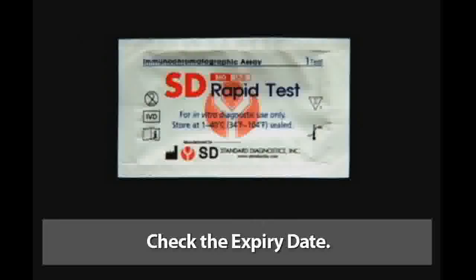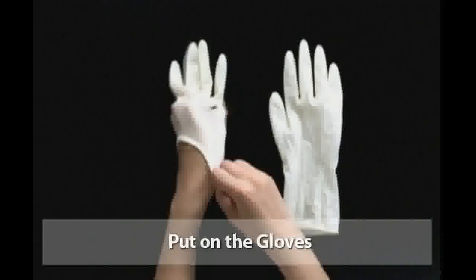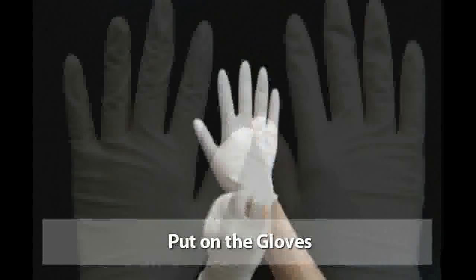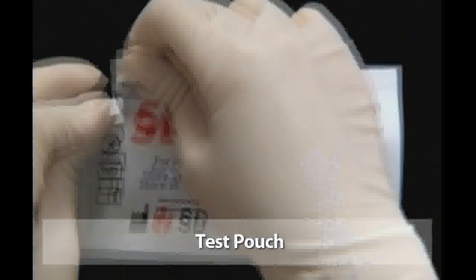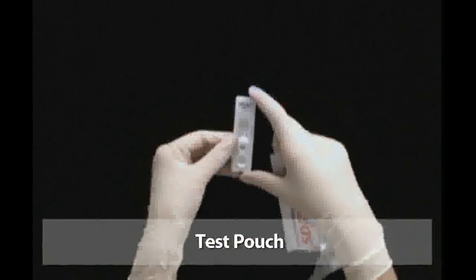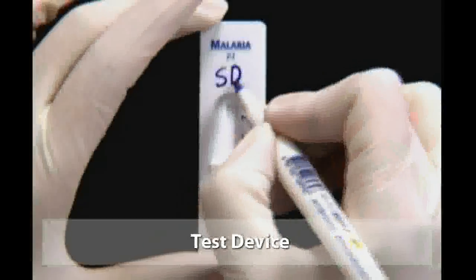Check the expiry date on the back side of the test pouch. If expiry date has passed, use another kit. Put on the gloves. Remember, use new gloves for each patient. Open the test pouch and set the test device. Write the patient's name on the test.